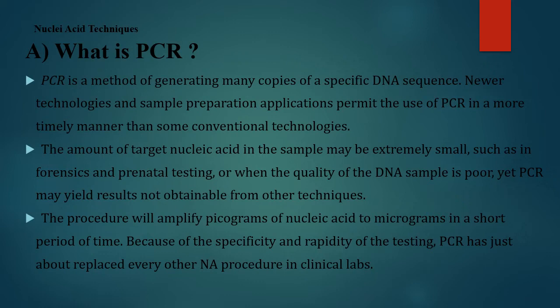Now, this PCR procedure will amplify picograms of nucleic acids to micrograms in a short period of time. So you have a picogram, and in a short time you have micrograms of that same nucleic acid. Because of the specificity and rapidity of the testing, PCR has just about replaced every other nucleic acid procedure in clinical labs. So there are many other procedures, but the use of PCR has become a major stake in our laboratory testing.